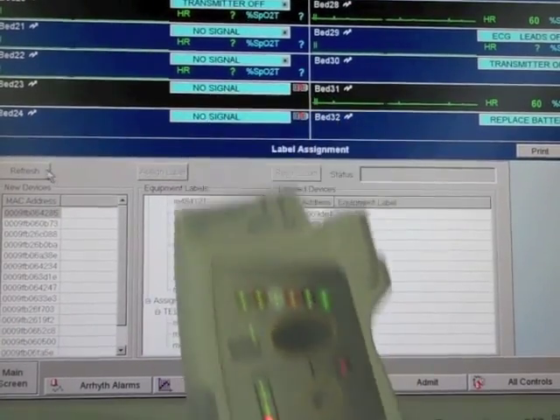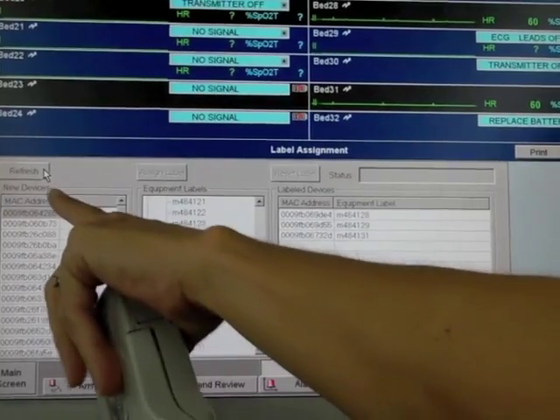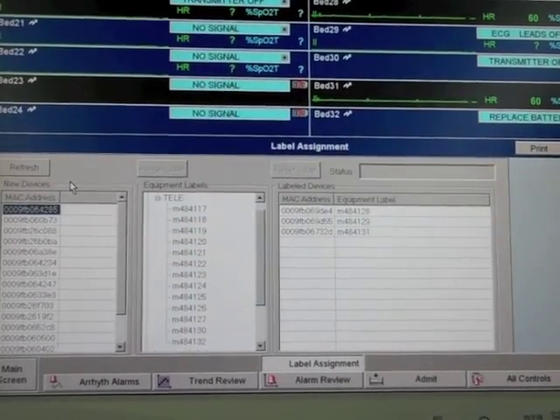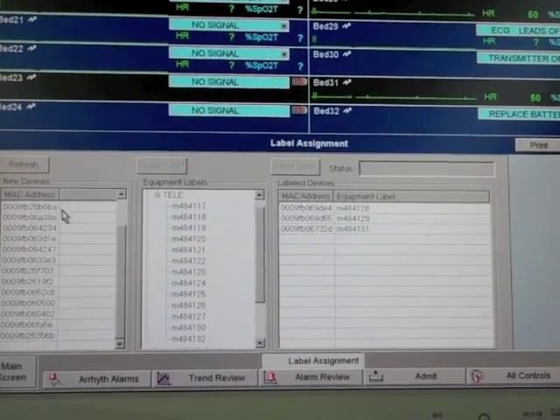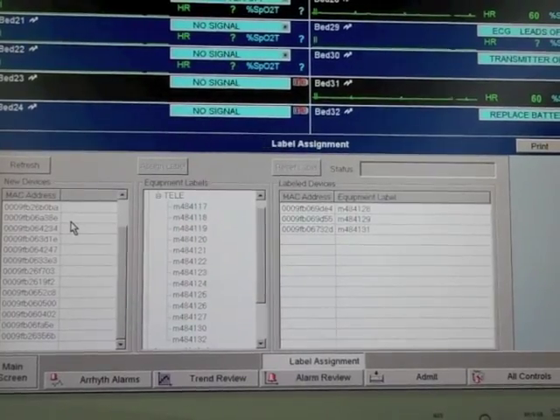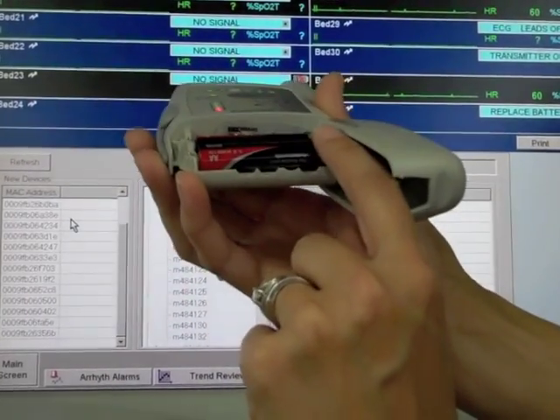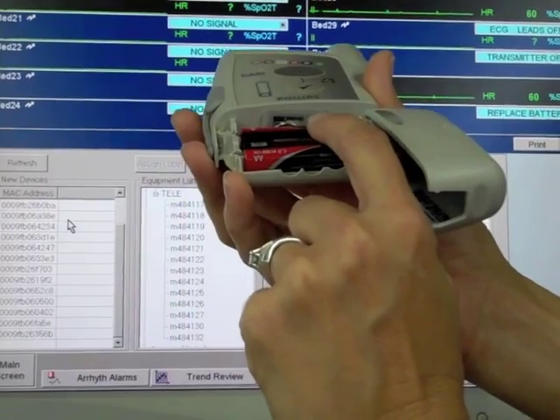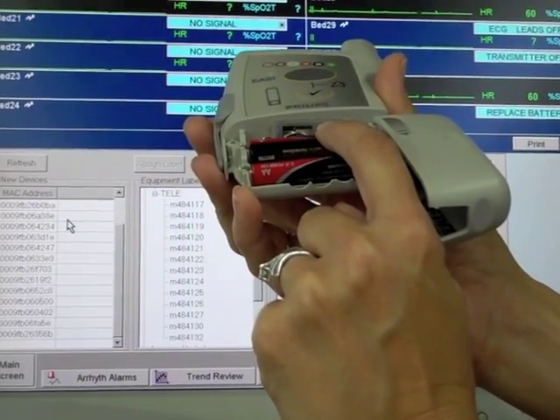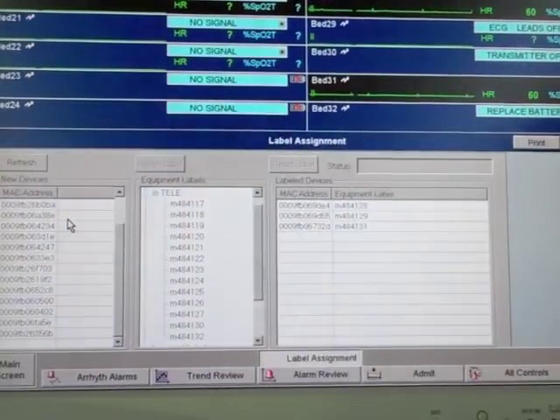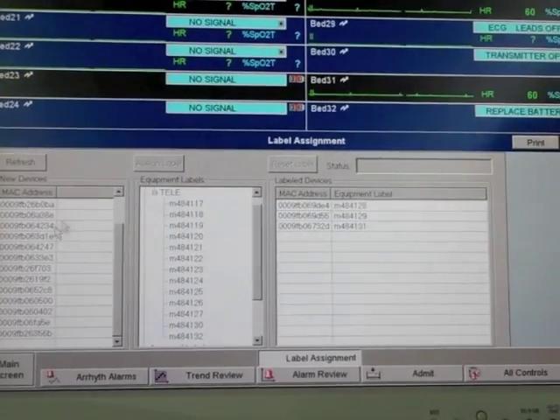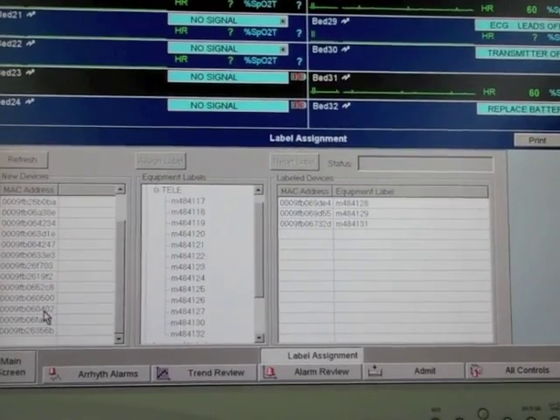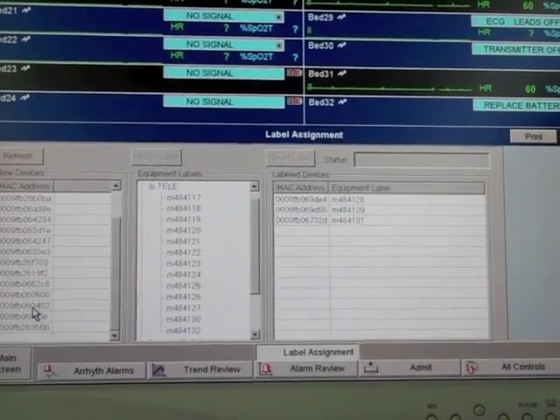You're going to hit your refresh button in the new device category and look for the MAC address assigned to this transmitter. Your MAC address is located underneath the battery door on the label up in front of the batteries. In this case ours ends in 60402.